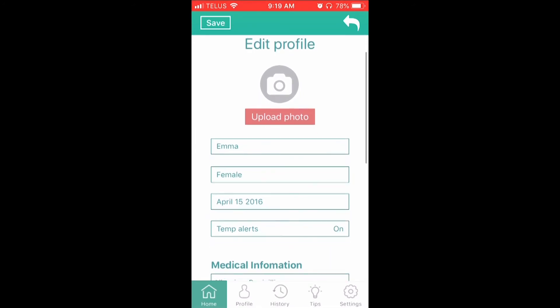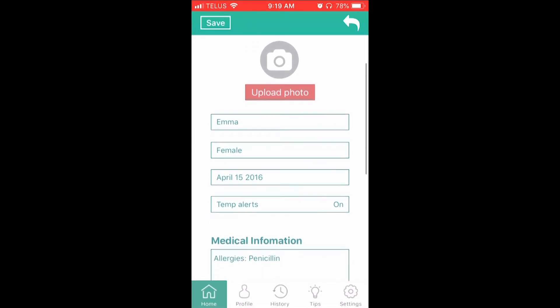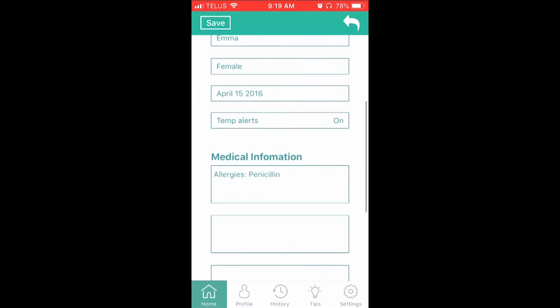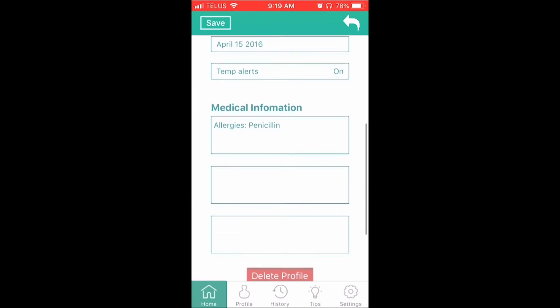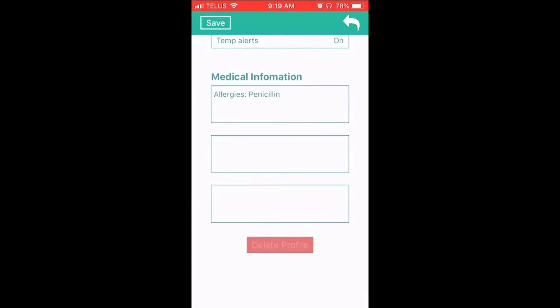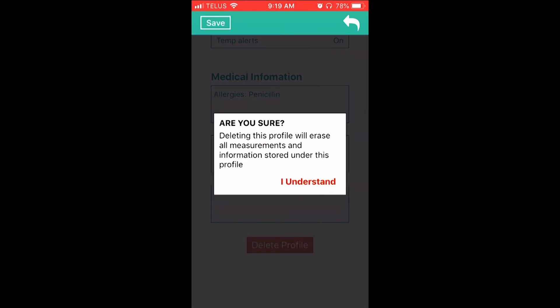If needed, you can delete a profile by clicking on the Delete Profile button located at the bottom of the screen. Once deleted, the profile and history cannot be recovered.